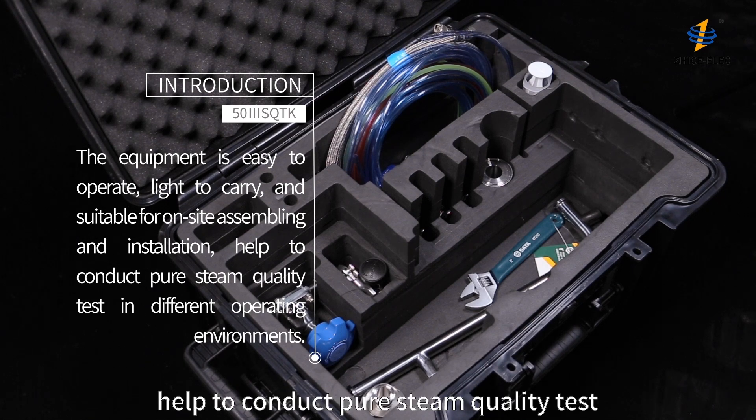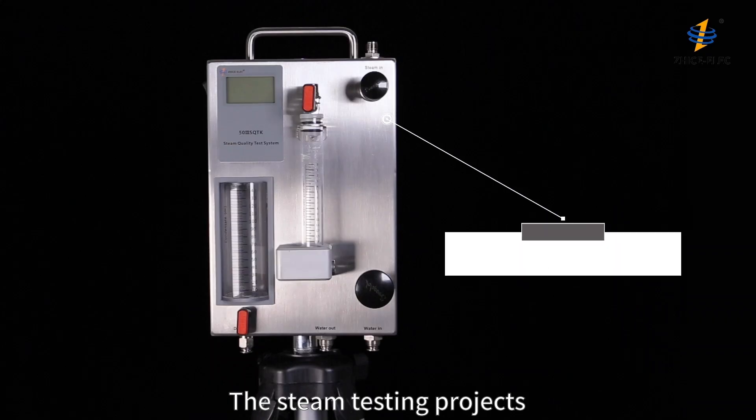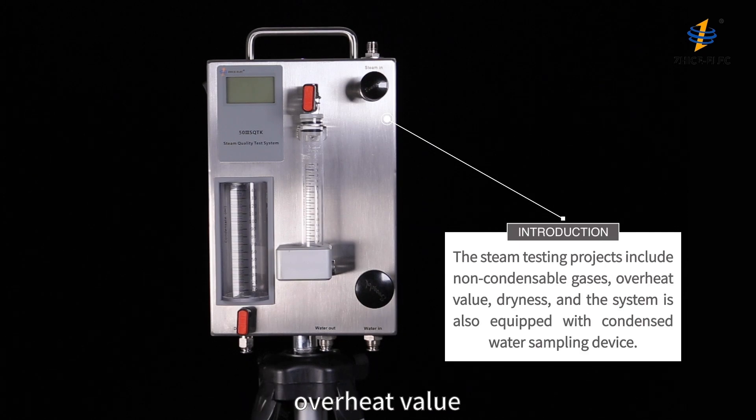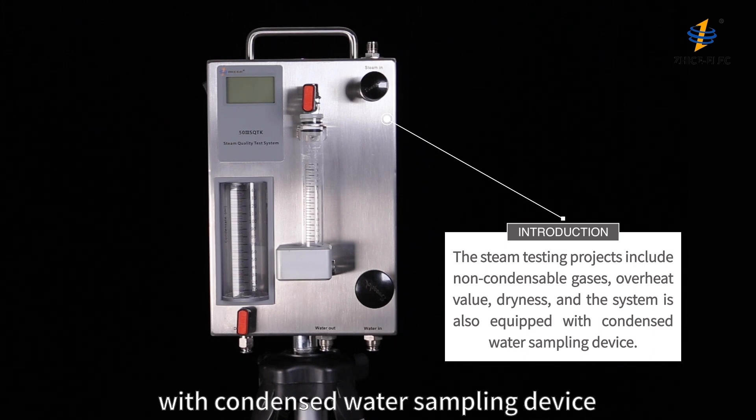The system helps conduct pure steam quality testing in different operating environments. The steam testing projects include non-condensable gases, overheat value, dryness, and the system is also equipped with a condensed water sampling device.